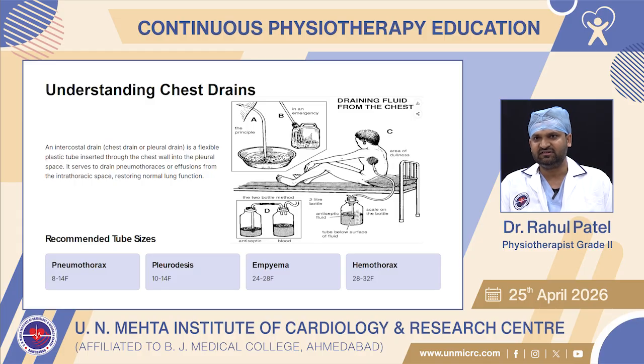Let's see the image: area of dullness, site of insertion, fifth intercostal space, an intercostal drain. Chest drain or pleural drain is a flexible plastic tube inserted through the chest wall into the pleural space. It serves to drain pneumothorax or effusion from intrathoracic space, restoring normal lung function.